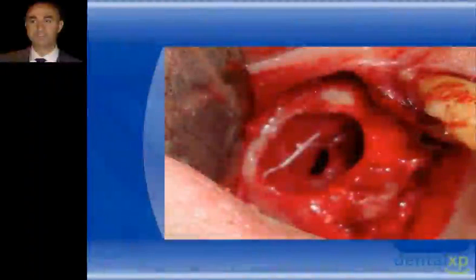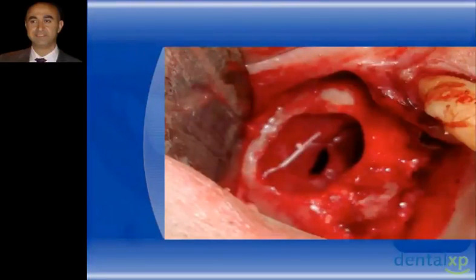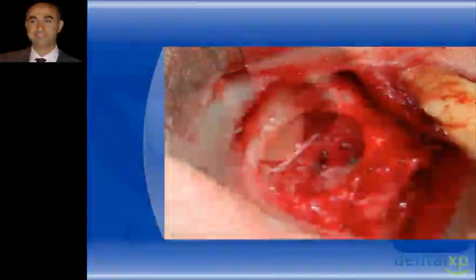Going back to our topic, again showing that complications of sinus elevations can still be handled, whether, as I showed you in the previous cases, we can place a membrane to fix the perforation, of course depending on the size of the perforation of the Schneiderian membrane. In very few cases I did suture the perforation, because the size of the perforation in the membrane was very large. I actually sutured it, which is a very hard technique, and I wouldn't try to do it actually, because you might just end up perforating and cutting the whole membrane and then placing the collagen membrane again.